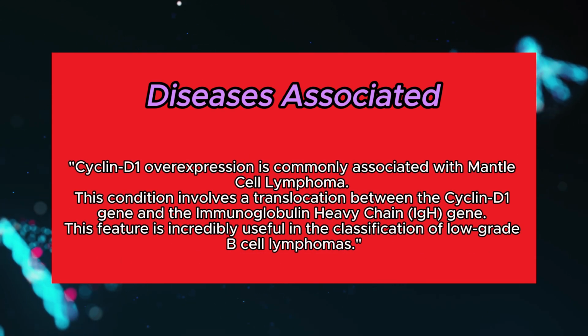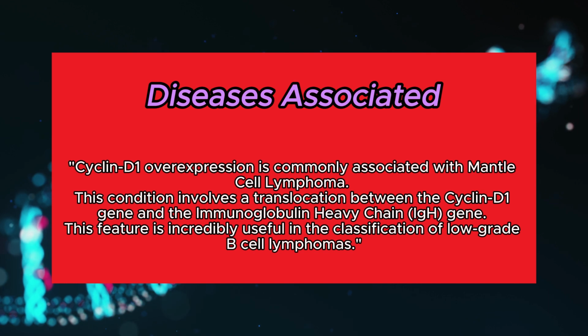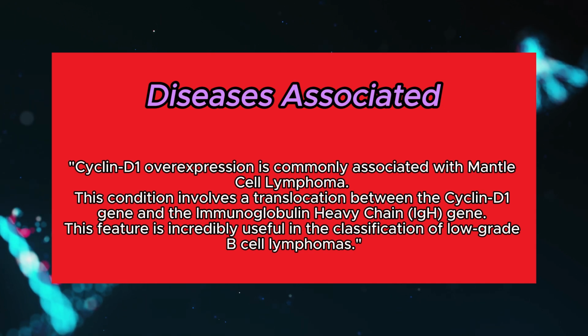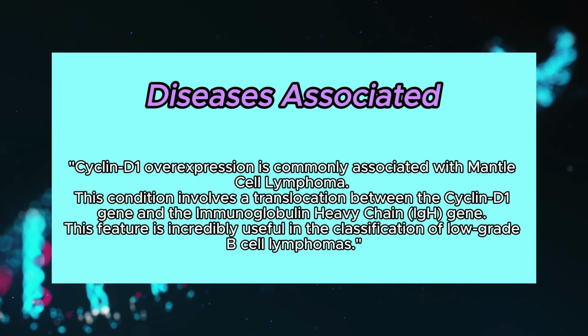Diseases associated. CYCLIN-D1 overexpression is commonly associated with mantle cell lymphoma. This condition involves a translocation between the CYCLIN-D1 gene and the immunoglobulin heavy chain gene. This feature is incredibly useful in the classification of low-grade B-cell lymphomas.